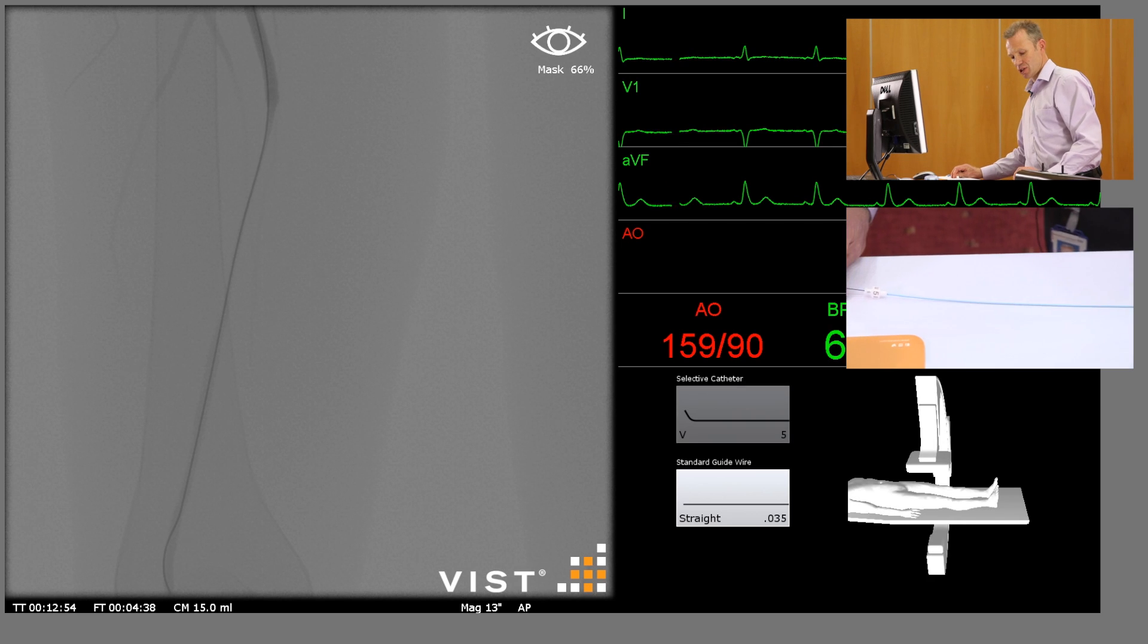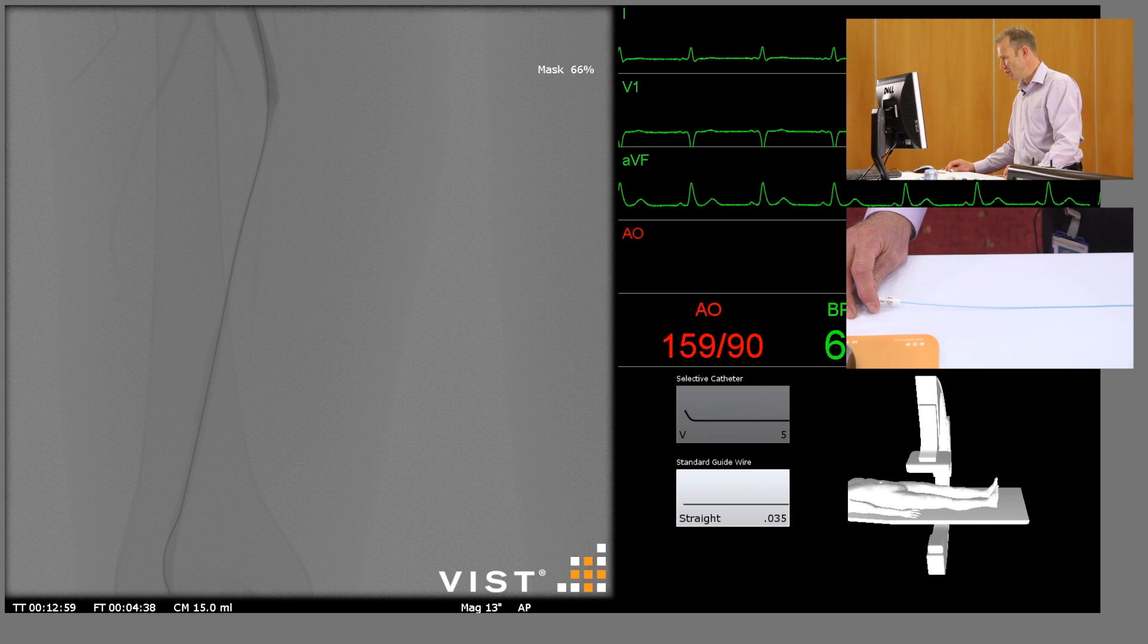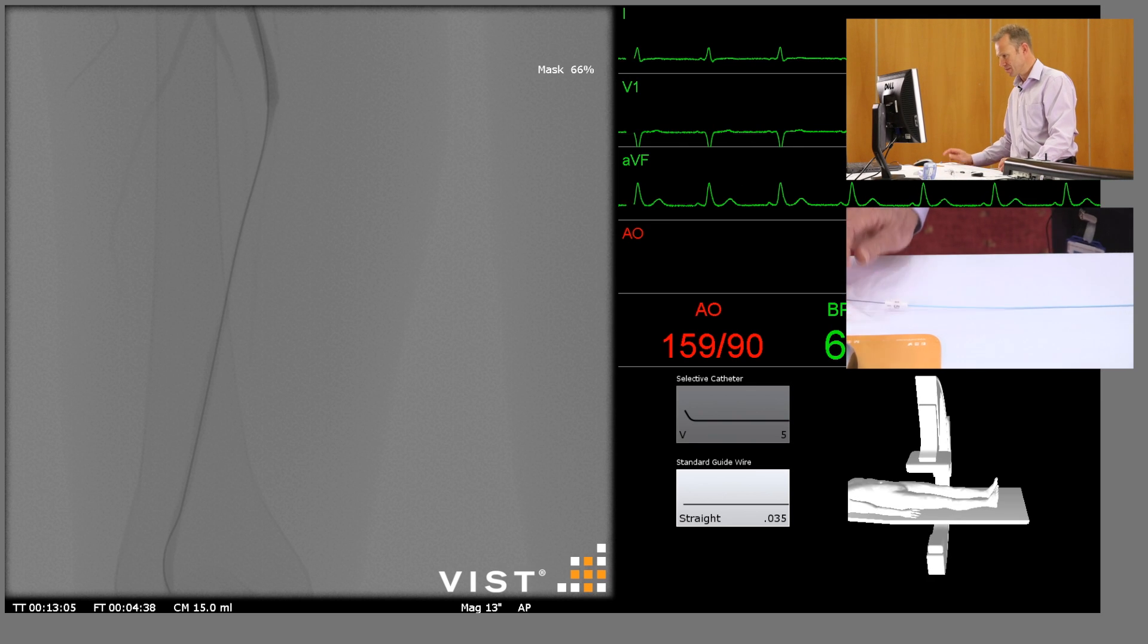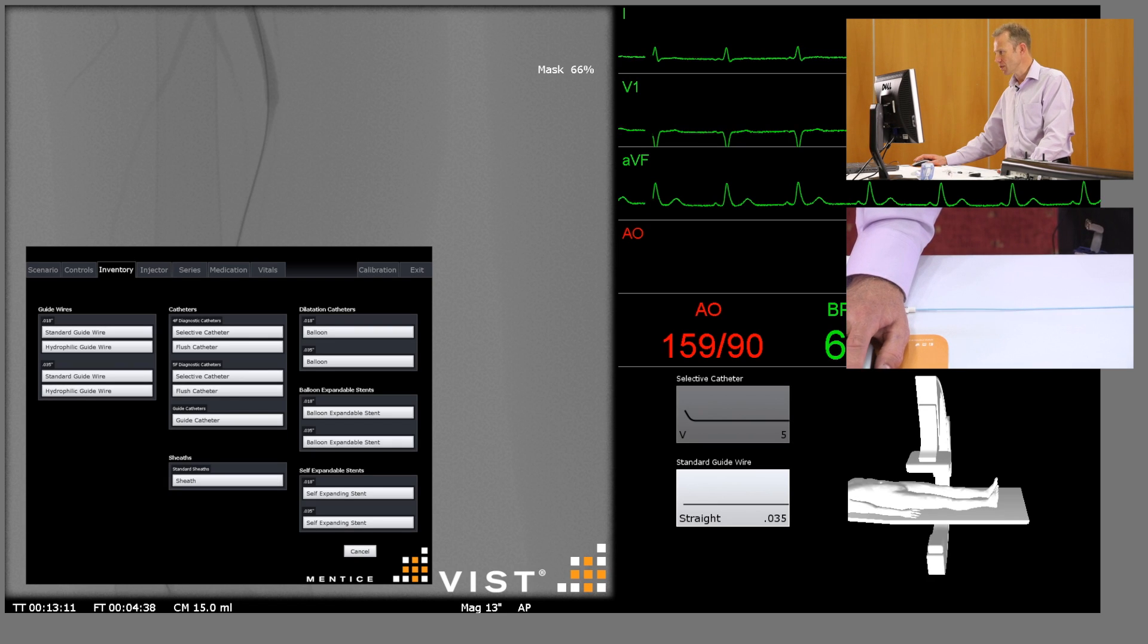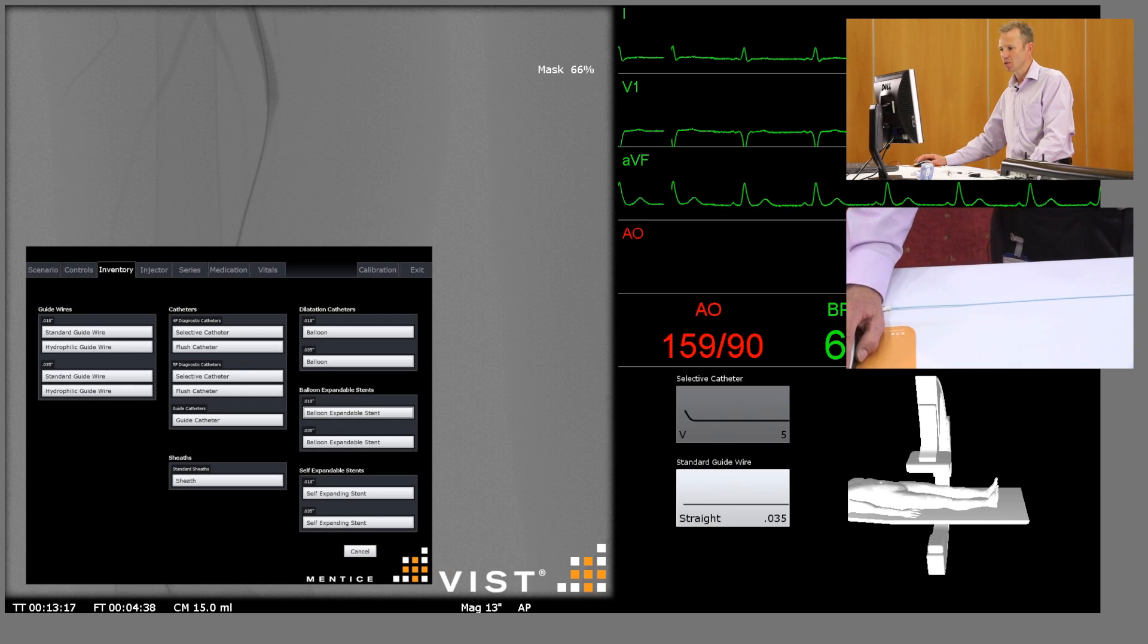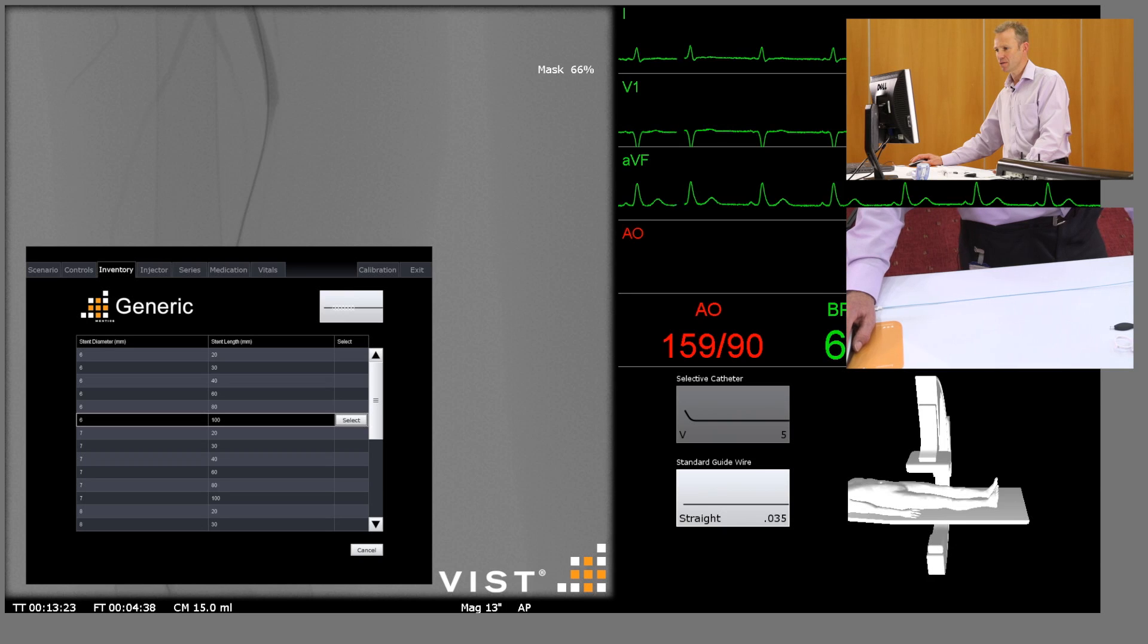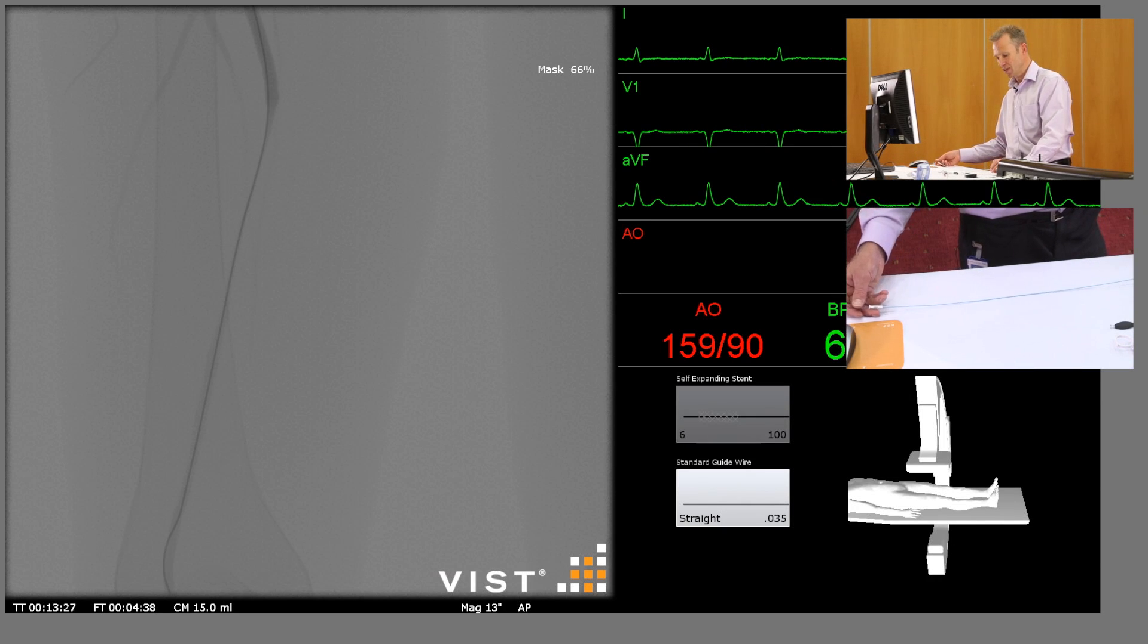We're going to insert our stent. Now we could be using a drug eluting stent here or a drug eluting angioplasty balloon, but for the purpose of this procedure I'm just going to show you deployment of a stent. I think our stenosis is approximately 14 centimeters long. The longest stent we have here is 10 centimeters, so I'm going to use a 10 centimeter by 6 millimeter self-expanding stent and then we're going to put a further shorter stent inside it, just overlapping.